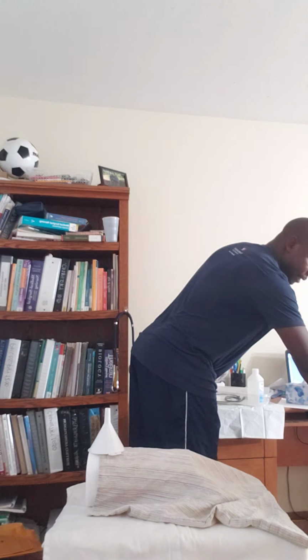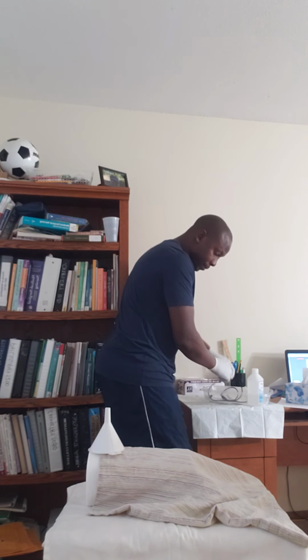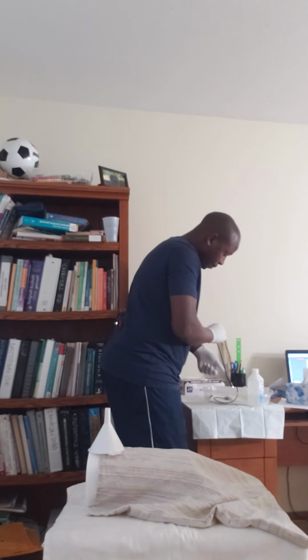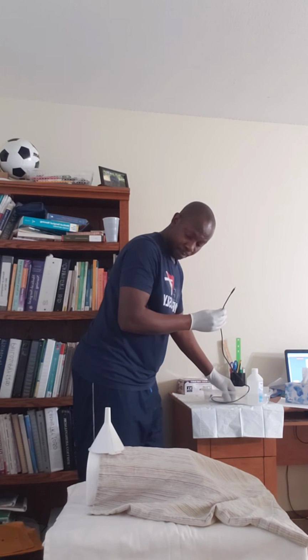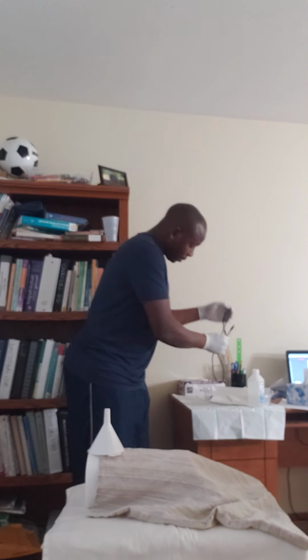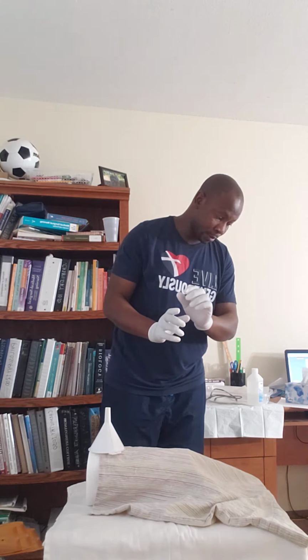When the saline is here, then I'm going to set up the tracheostomy. I'm going to remove the tube. That tube inside will be removed.